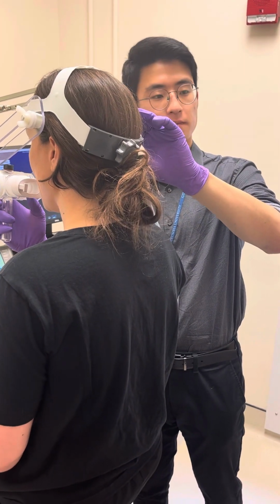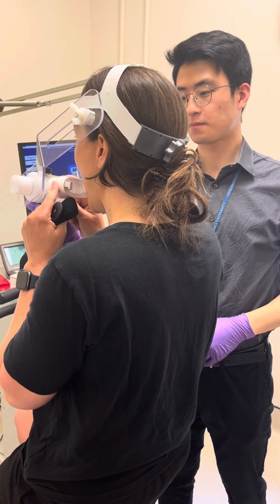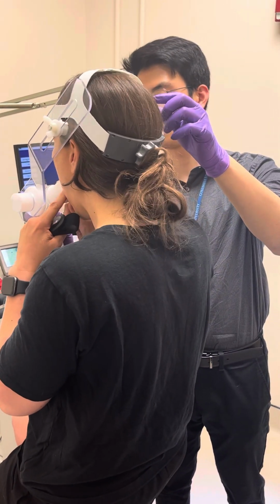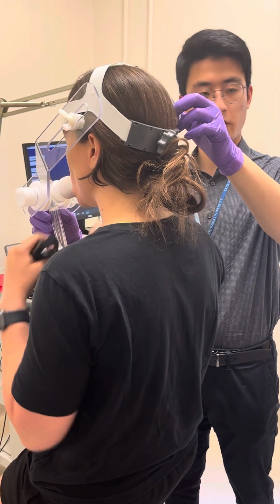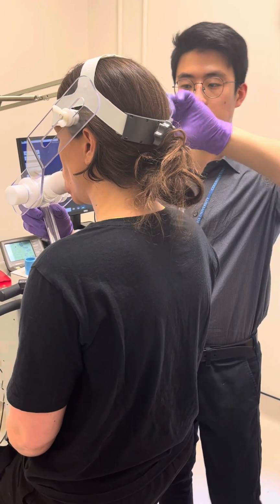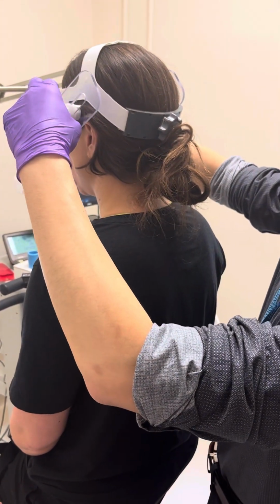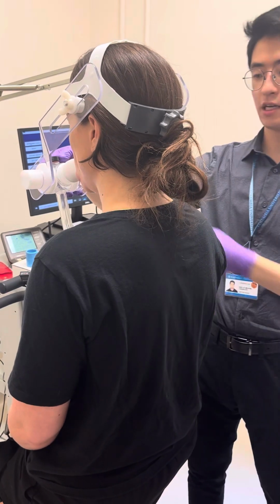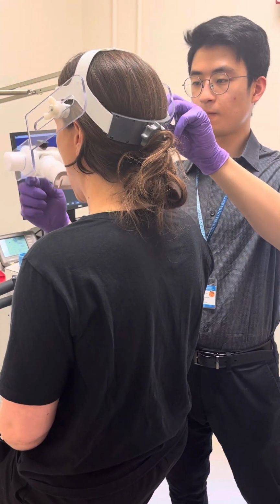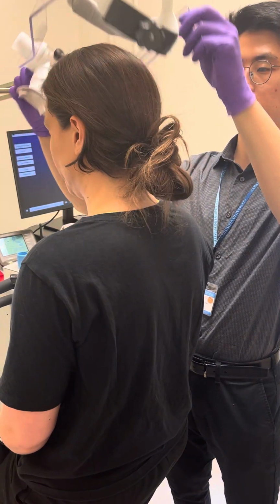Are there issues with gag reflex that you see with this? Sometimes. Yeah, because that will bother me. All right. So Katie's now biting down, so I'm going to tighten this side, and then tighten this side. So now this is set. So then we're going to take this out. Tighten a little bit. Take this off for now.